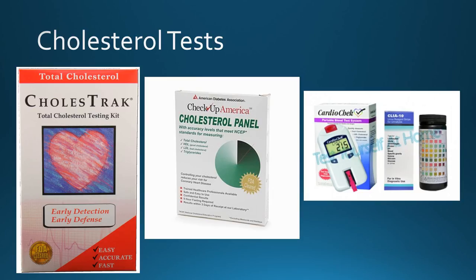Consumer Reports tested the CholestTrack, a First Check machine, and CardioCheck, and it said for the CholestTrack and the First Check that the two tests had results that varied no more than 15% from the lab values, and so that they were fairly good to use, but a 15% variance is a pretty big variance in my opinion, and something that I'd really rather the patient get tested at a lab.